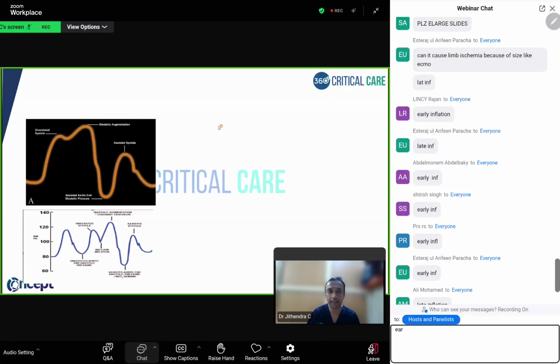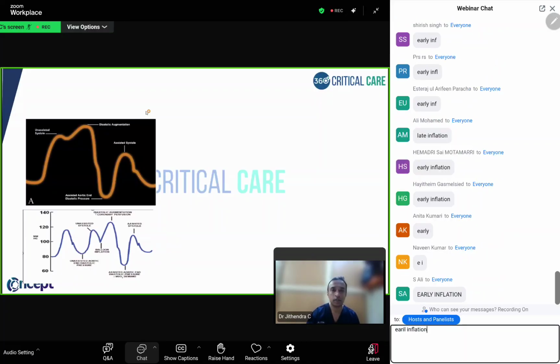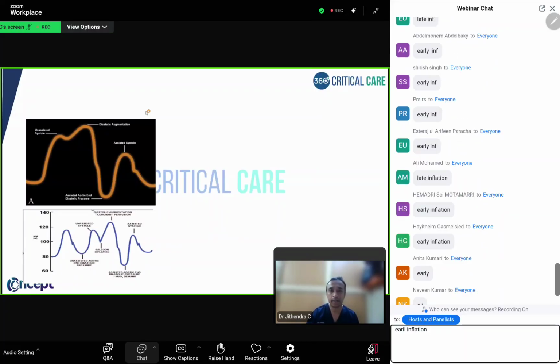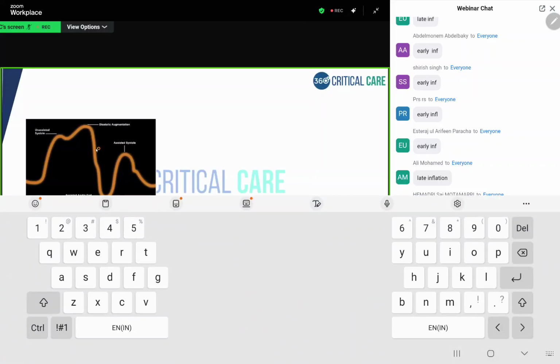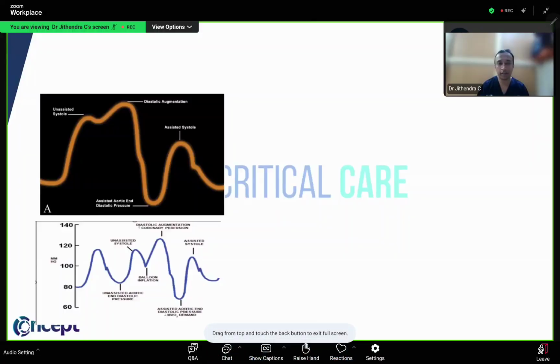Yeah, we already have a few answers. So this is early inflation, right? You can see before the dicrotic notch itself, the augmentation has happened. So see, this is what it is. This is the first thing we will be asked in your CBS question. So what is the abnormality? It is early inflation.